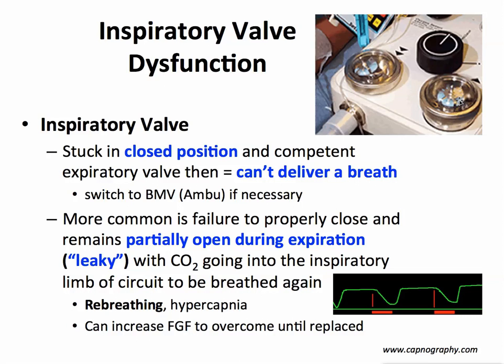More common with the inspiratory valve, however, is failure to properly close, and it's just leaky or partially open during expiration, meaning that CO2 will go back up the inspiratory limb of the circuit and with the next breath be rebreathed. So rebreathing, as evidenced by elevations of baseline end tidal CO2, will be present.